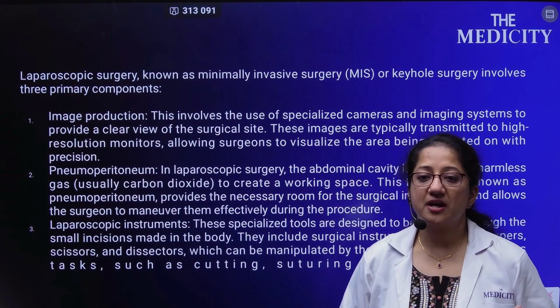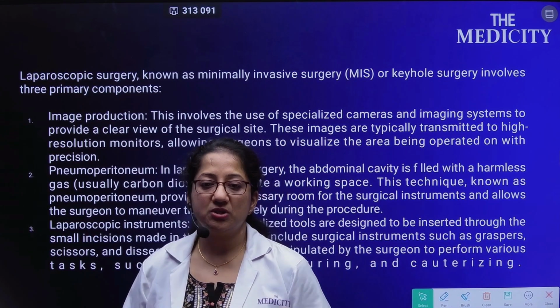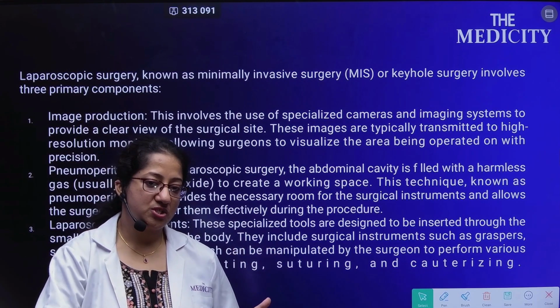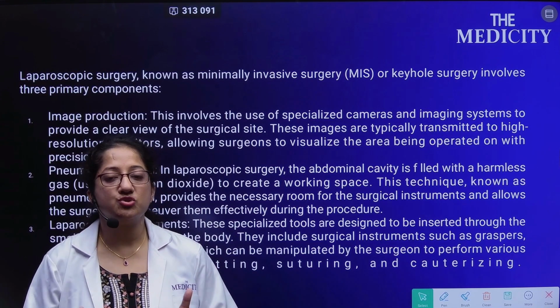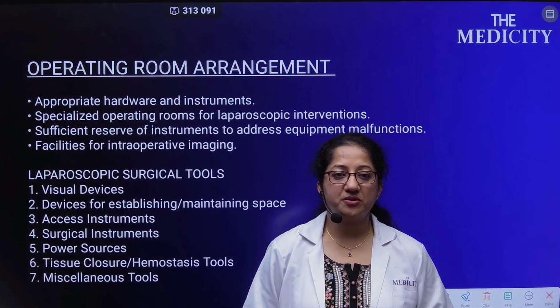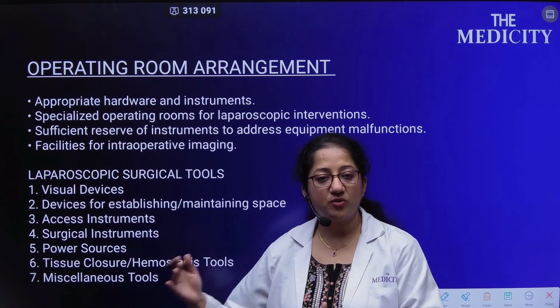Laparoscopic instruments are specialized tools which are designed to be inserted through the small keyhole, and they help in surgical procedures. They can be graspers, scissors, dissectors, and manipulators which help in cutting, suturing, and cautery. So, an appropriate hardware and instrument is very important. It is important to have a good technician who can take care of all the instruments.